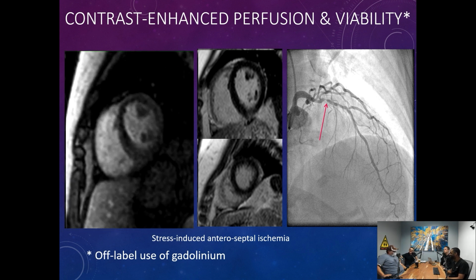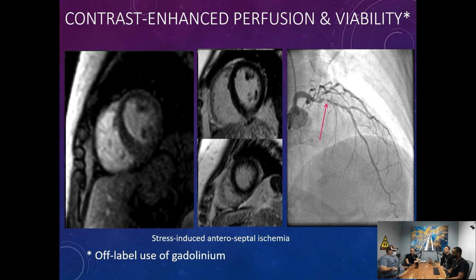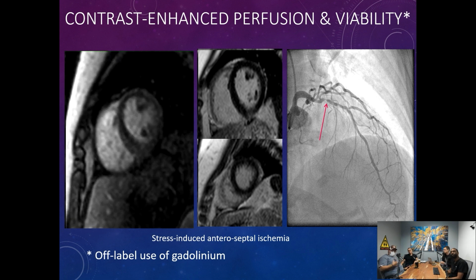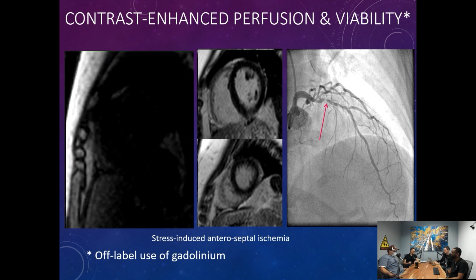That's the other important point with cardiac imaging, we have all these time constraints. The heart's beating, the patient's breathing, they have to hold their breath. The thing you have to remember with some of these pulse sequences, especially the T2, is it's like a horse basically, and sometimes you have to let the horse rest so it can run again. If you just keep beating this horse and don't give this signal time to recover so that you have something to work with for your next pulse, you can get some erroneous exams. Your T2s might not look like there's any T2 signal.